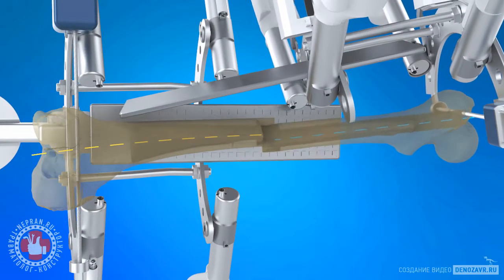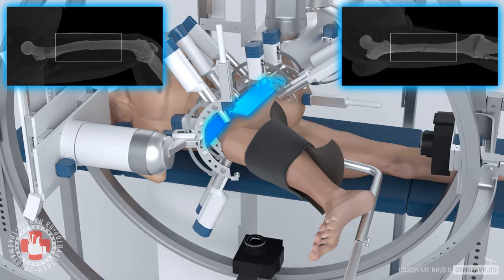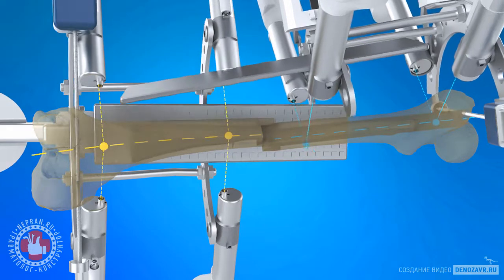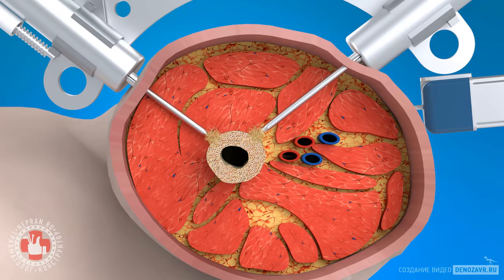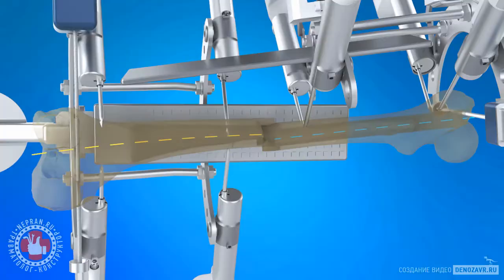Repeated X-ray control. Then the tool exit axis and the fragments axis are recombined, and then the fragments are drilled with 2 pairs of spokes, without overlapping, and the bone marrow canal is tightly compressed due to the longitudinal and the angular movement of the tool, and the fragments are precisely matched. Pass-through threaded spokes are automatically removed.